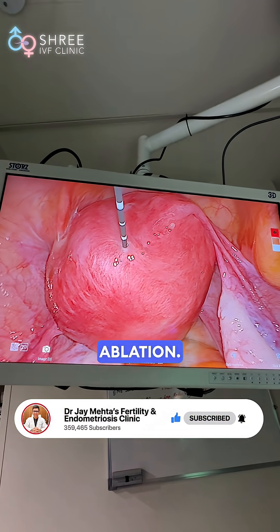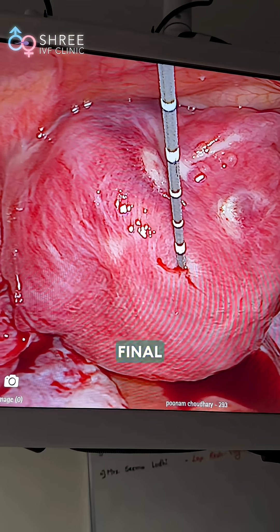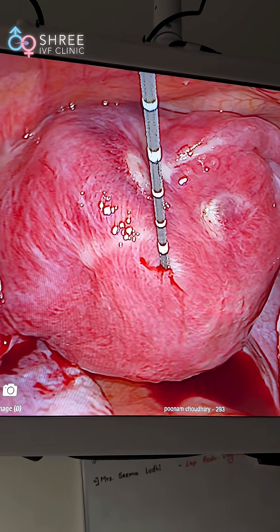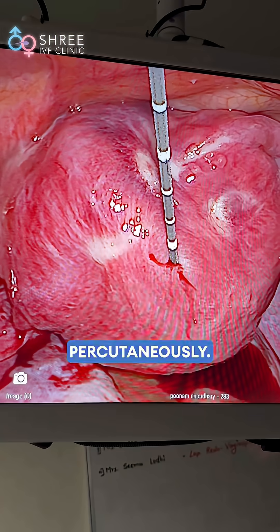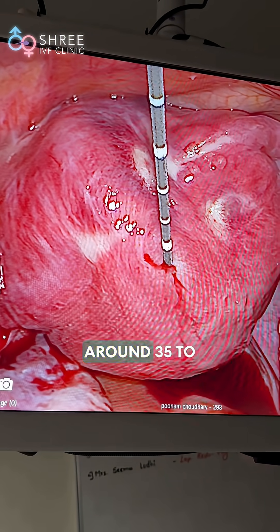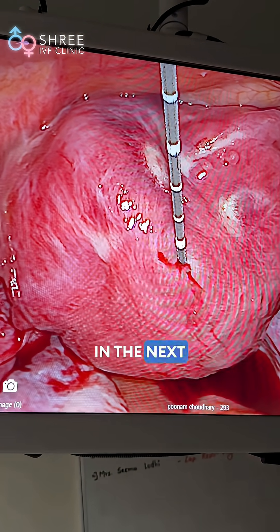We will now begin the ablation. This is the final picture after approximately 4 shots of ablation. The entire procedure finishes percutaneously. There will be 99% pain relief and a volume reduction of around 35 to 40% over the next 3 months.